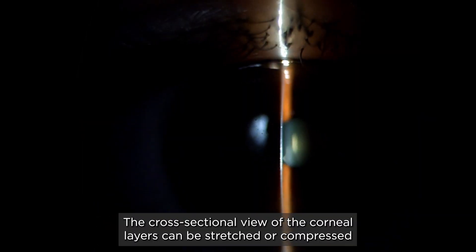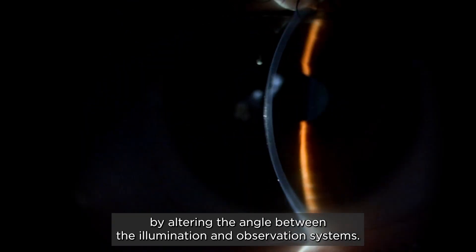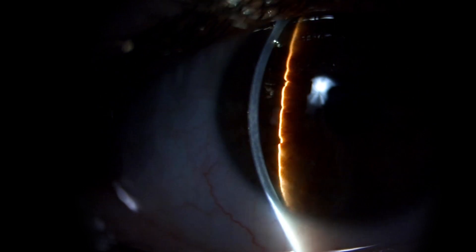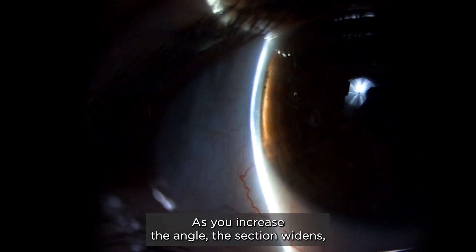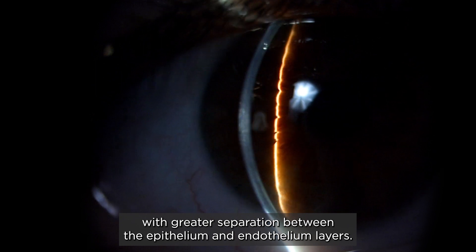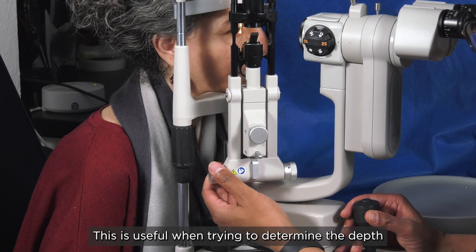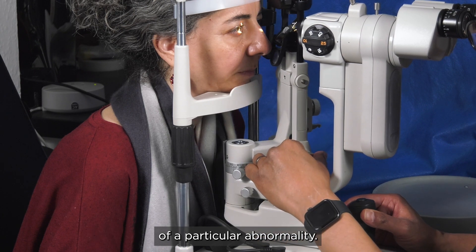The cross-sectional view of the corneal layers can be stretched or compressed by altering the angle between the illumination and observation systems. As you increase the angle, the section widens with greater separation between the epithelium and endothelium layers. This is useful when trying to determine the depth of a particular abnormality.